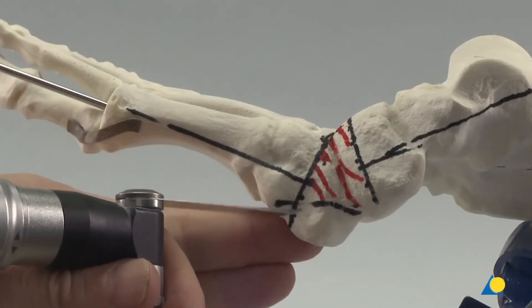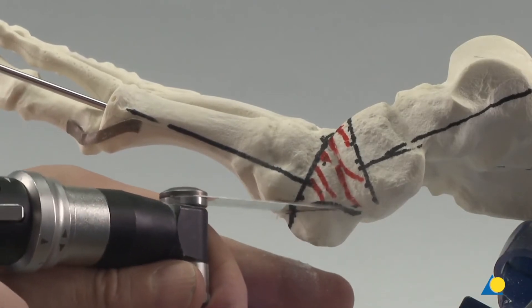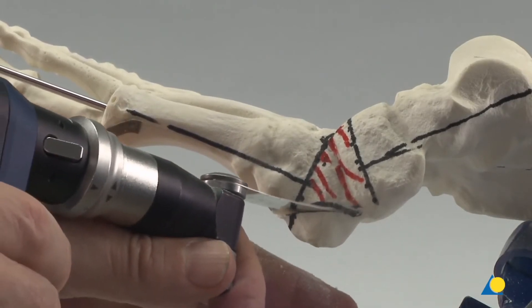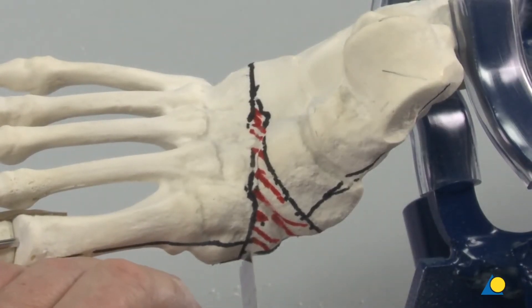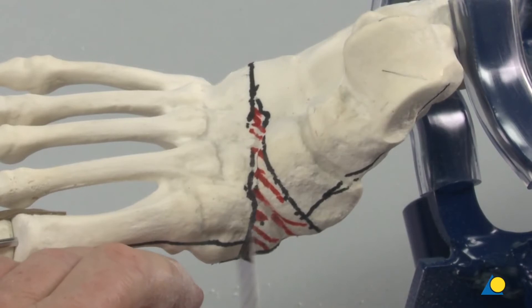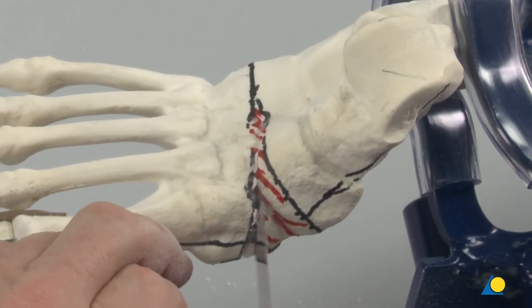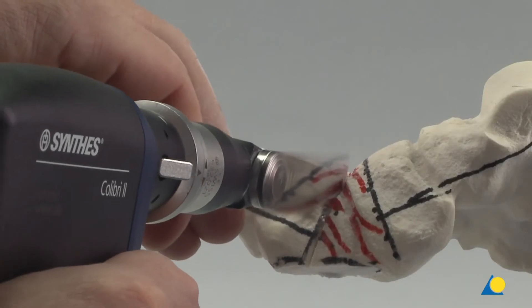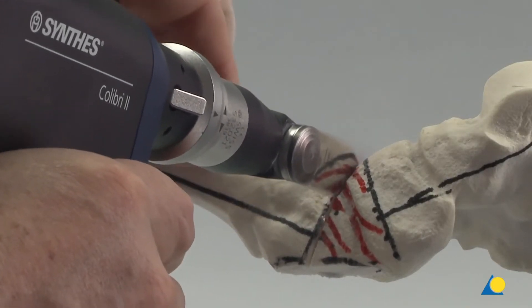The saw is used to remove the bony prominence from the plantar aspect. The distal cut is sawn perpendicular to the axis of the forefoot. To protect the anatomical structures in the tarsal tunnel, care is taken to cut up and over.